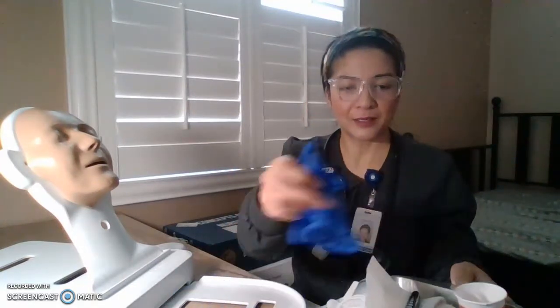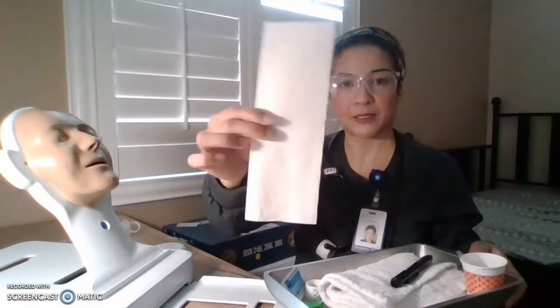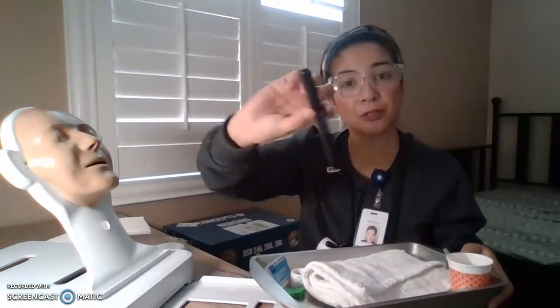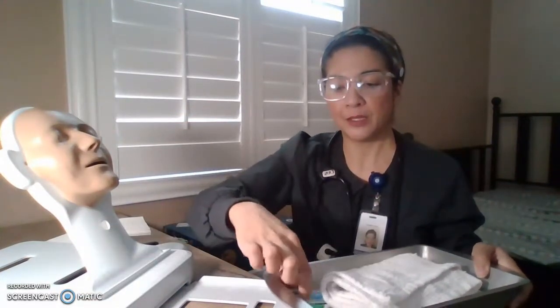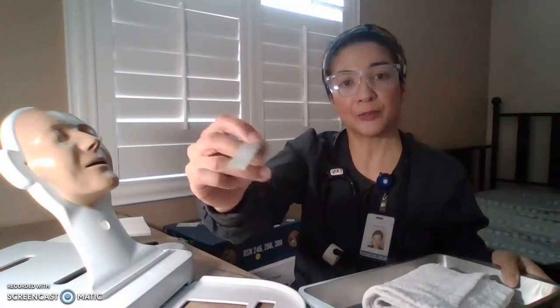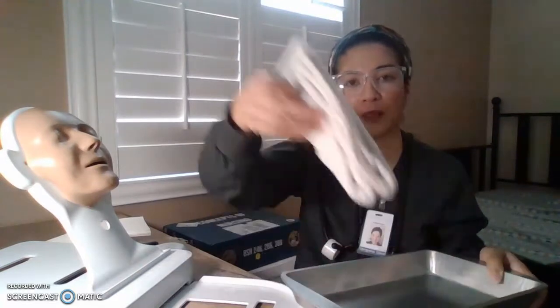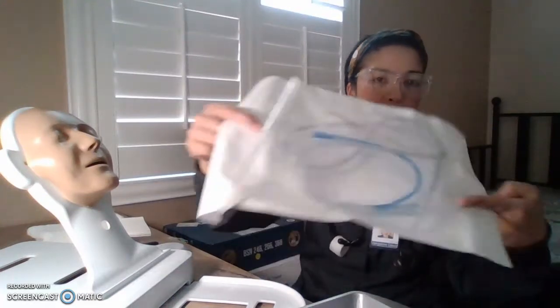Okay, so now let's go through our supplies. Of course, we have our gloves, our 60 cc or ml syringe, some tissue, good to have a pen light, a cup with water, your tape, lubricating jelly, water base, and your pH strip, a towel, your emesis basin, your stethoscope, and of course your tubing.